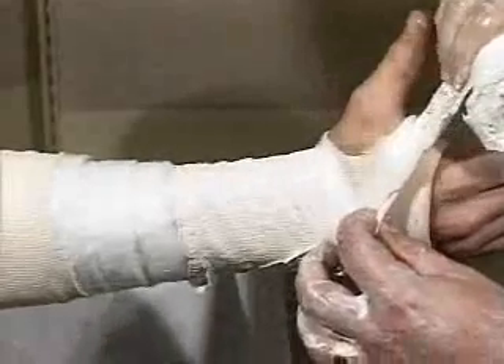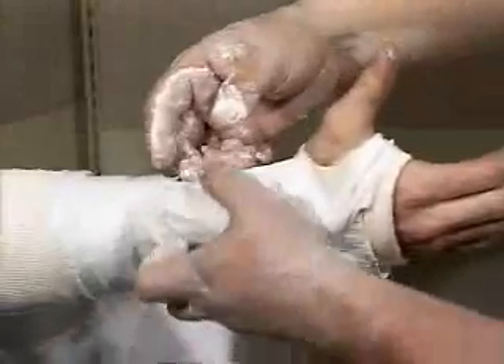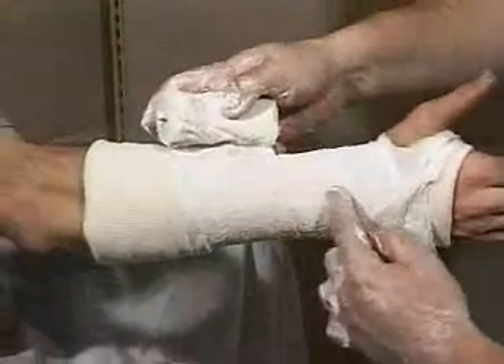Start the plaster at the wrist, then wrap around the hand twice, pinching the material through the first web space. The wrist should be in neutral position. Extend the cast proximally to the elbow, overlapping the previous layers by two thirds.